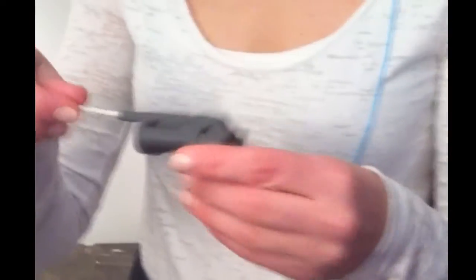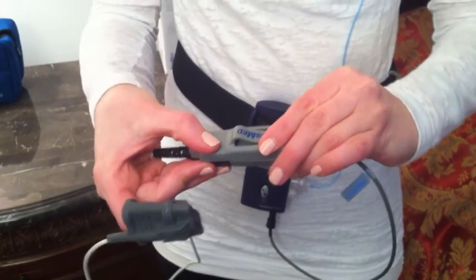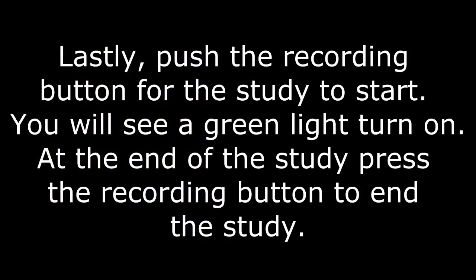Make sure that the cord will end up on top. You can tape it if you think it will fall off during sleep. Put the gray clip to secure the two cords in place. Lastly, push the recording button for the study to start.